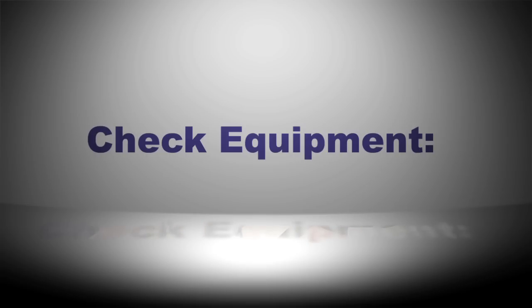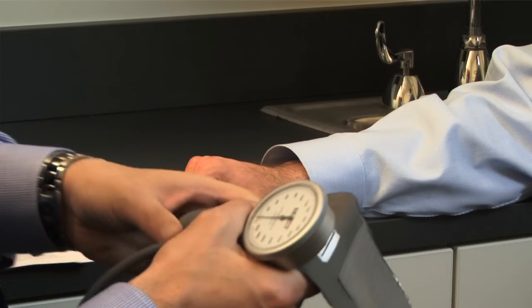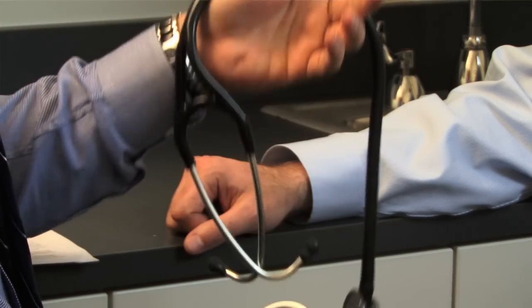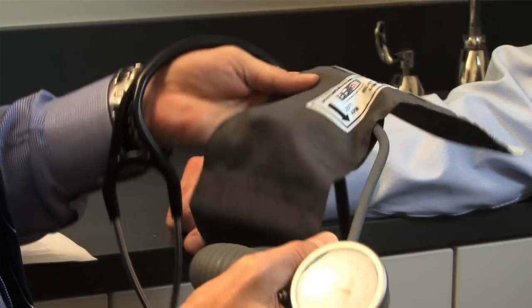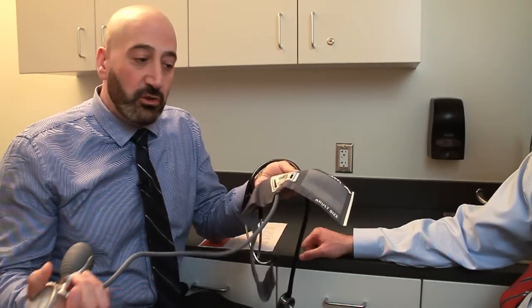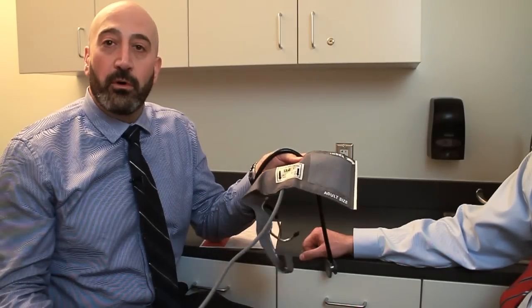The first step is to select your equipment and do a visual inspection. When measuring blood pressure manually, you need a stethoscope and a blood pressure cuff with a manometer. The first visual check is to make sure there are no leaks in the tubing related to either the stethoscope or the blood pressure cuff.